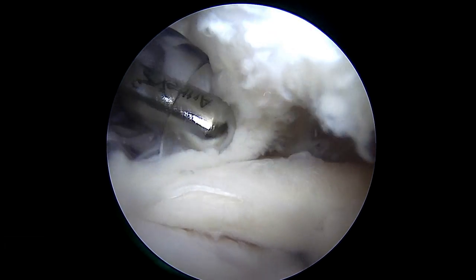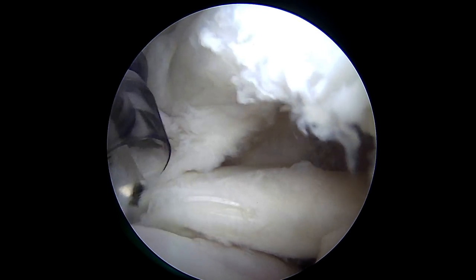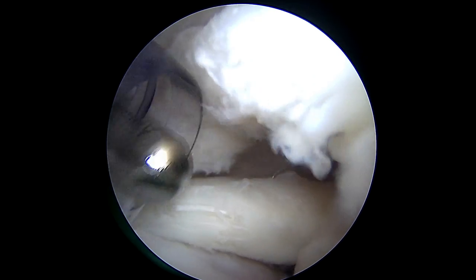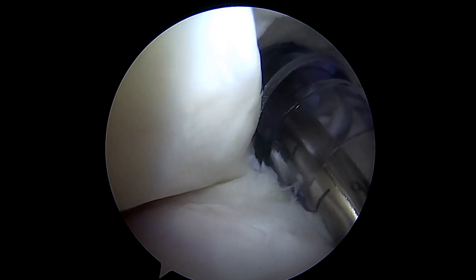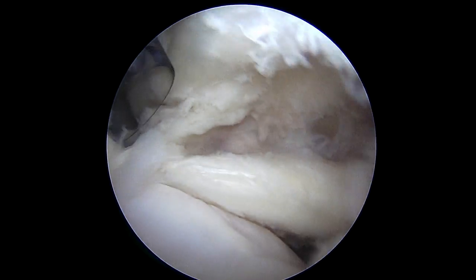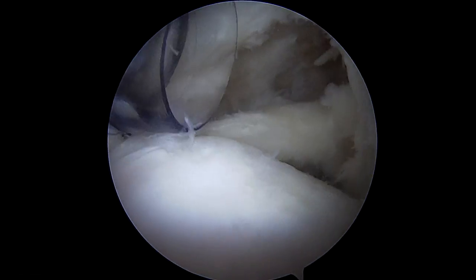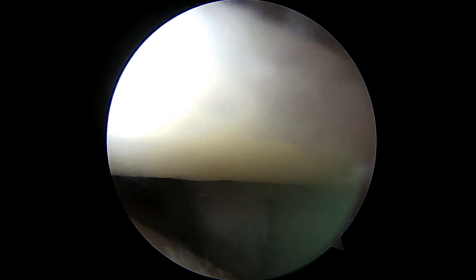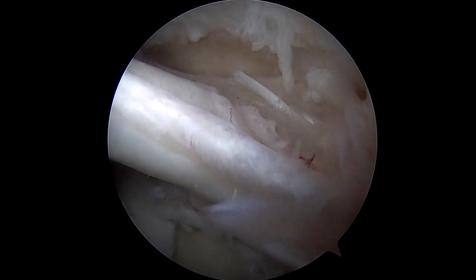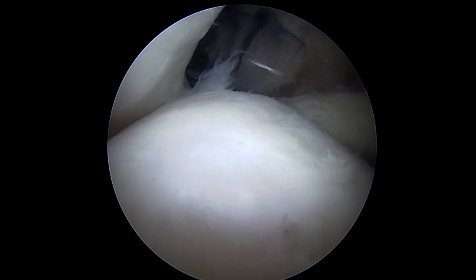It's interesting because it looks like his subscap is intact. He's been inconsistent on having a bear hug belly press, so he was negative this morning on testing. He's got some biceps tension signs, so we're going to go ahead and do a tenodesis. Most of the time if we're going to do an SCR, we end up doing a tenodesis anyway because you end up with a poor labral attachment if you try to leave it and then clean up around the labrum.